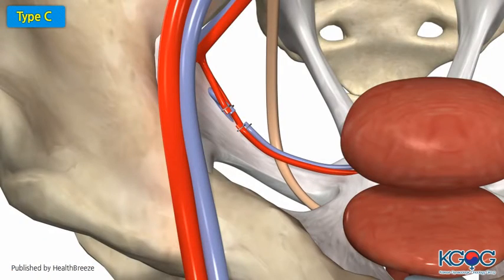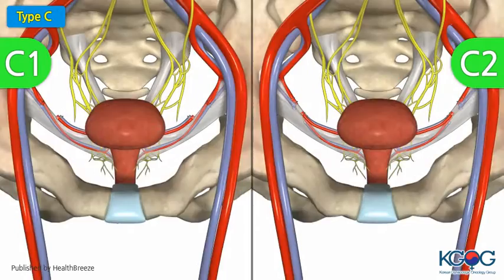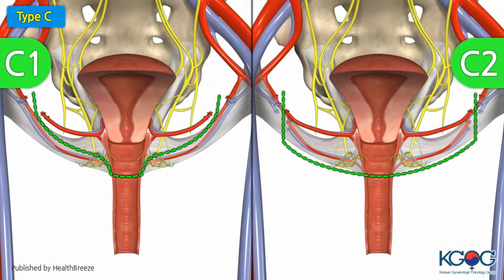The ureter is mobilized completely, and 15 to 20 millimeters of vagina from the tumor or cervix and the corresponding pericolpos is resected, depending on vaginal and paracervical extent and on the surgeon's preference.